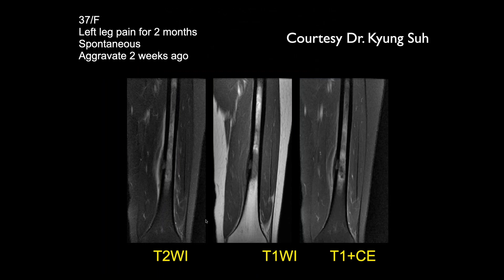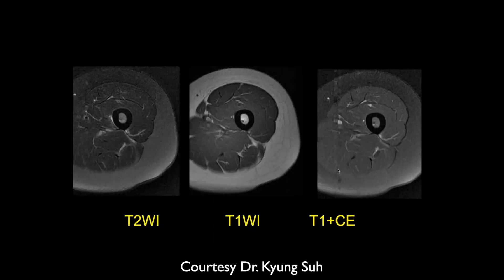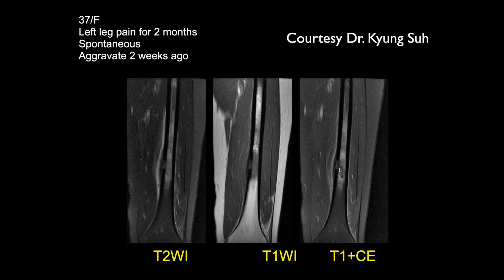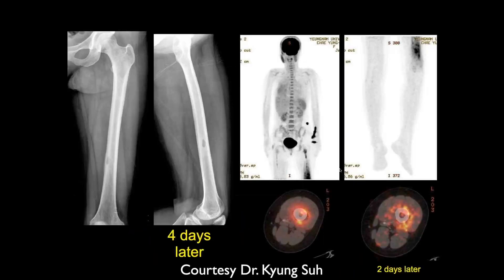This is a 37-year-old female with left-leg pain for two months. It was spontaneous and was aggravated two weeks ago. You can see periosteal reaction and line thickening, and some moderate bone marrow edema adjacent to that and slightly more proximal, extending upwards. There's also maybe a small focus of contrast enhancement of the edema. It looks like it's in the cortex — you can see cortical problems and cortical thickening.